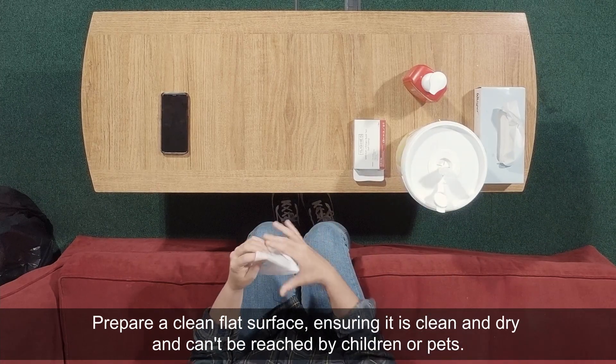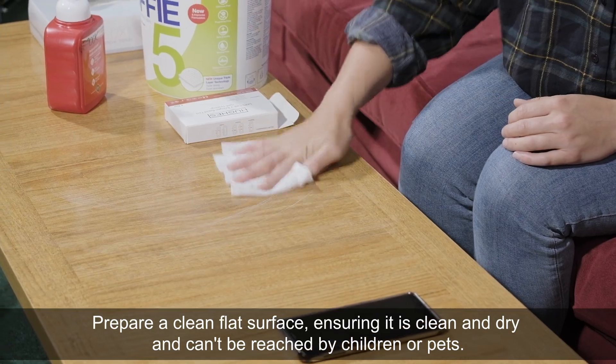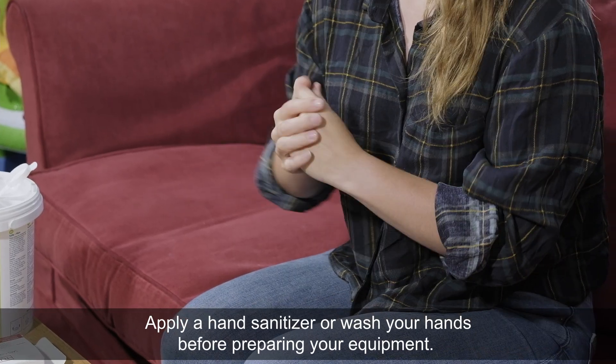Prepare a clean flat surface, ensuring it is clean and dry and can't be reached by children or pets. Apply a hand sanitiser or wash your hands before preparing your equipment.